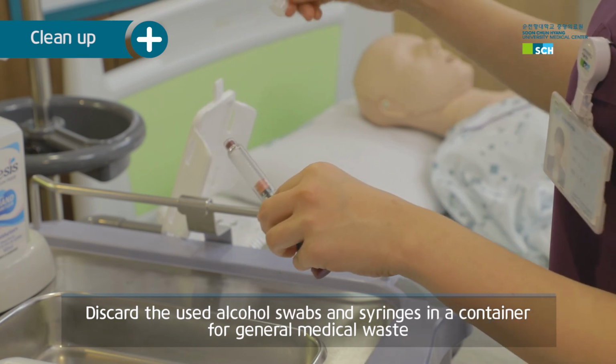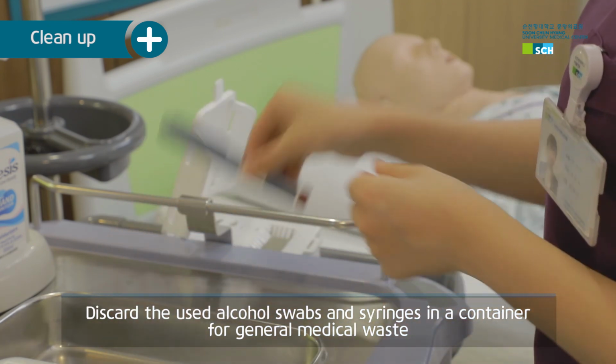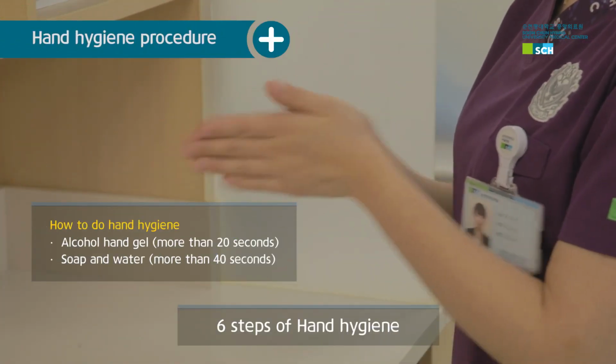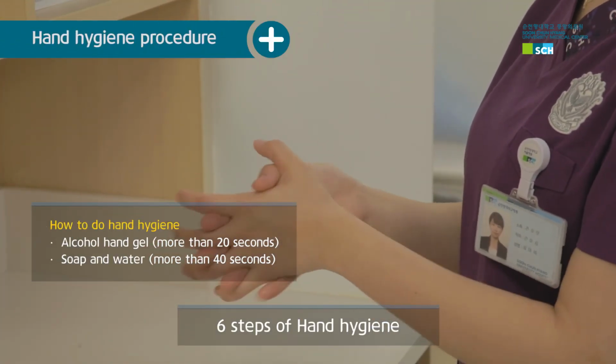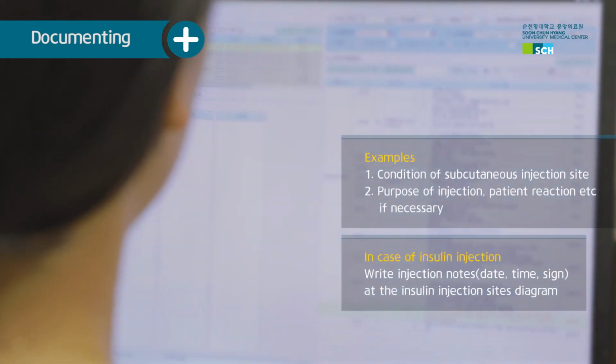Dispose of the needle in a container for sharp wastes, and discard the used disinfectant cotton and syringe in a container for general medical waste. Perform hand hygiene. Document the result and patient's condition in the nursing charts.